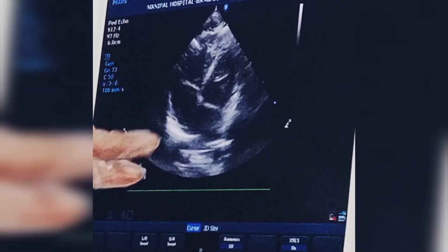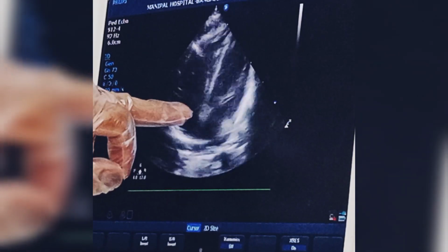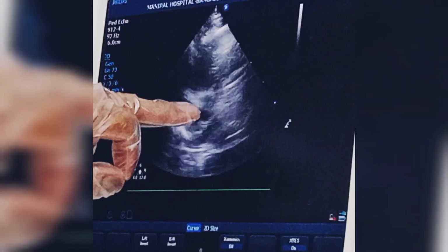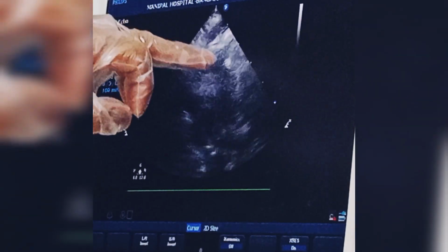Okay, normally in 5-chamber view, 5-chamber view is nothing but 4-chamber view with aorta open. Can you see that? Aorta open. This is a 5-chamber view and it is normal. There is no branching you see. And still if you keep that opening, you can see that right ventricle open into the pulmonary artery. So now we will see what will happen, the same changes in transposition of great vessels.